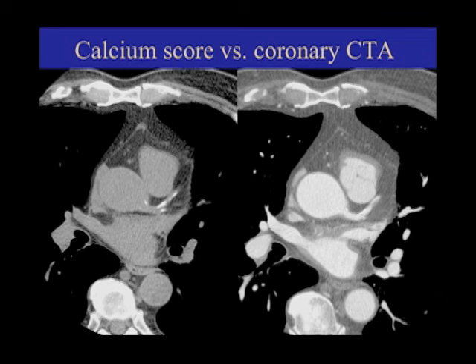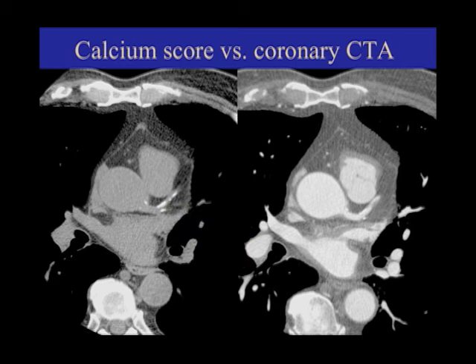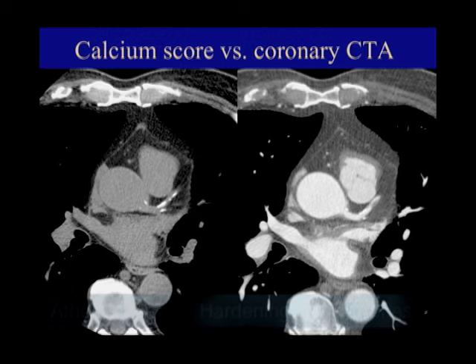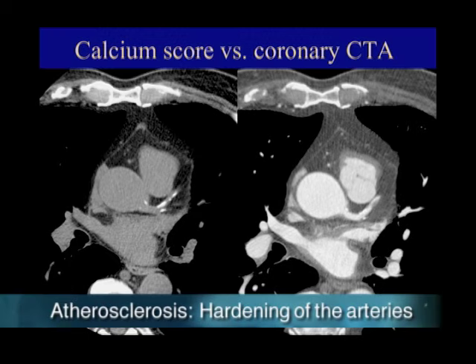What we're seeing here is actually quite a bit of calcium in the coronary arteries. I can't tell you that this right here is causing a blockage, but I can tell you that this person has a lot of atherosclerosis. So they're at pretty high risk for developing a problem — I don't know where that problem is going to happen, but their chances are relatively high.